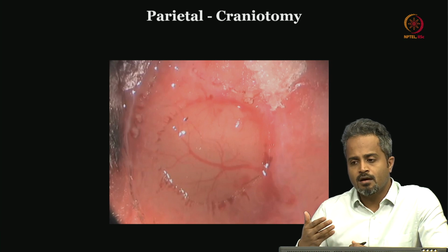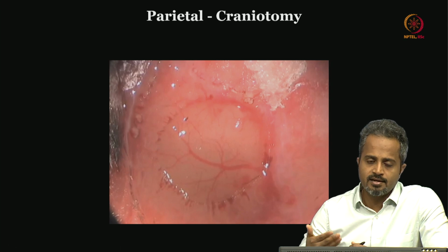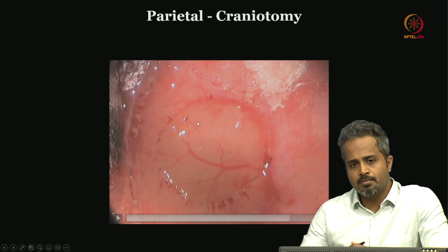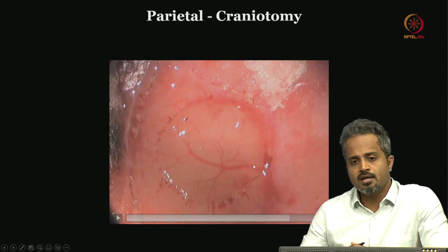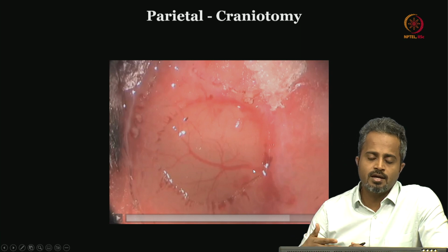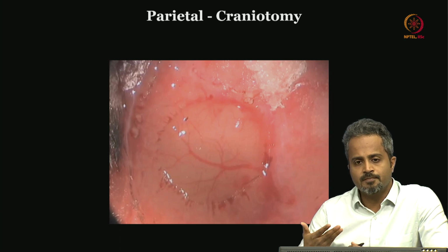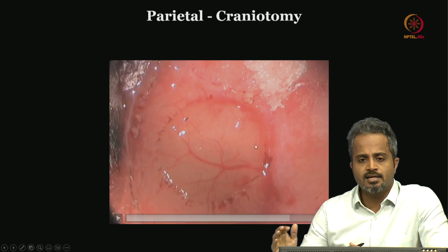All right, there are many instruments. A flat dissector usually is used to keep the dura intact before you lift up the skull. If the dura tears along with the skull, usually you can see here there is this vessel which can get injured, and if it starts bleeding, that part of the area which you actually wanted to study will get destroyed. It's called an ischemic infarct or stroke. That can happen because of iatrogenic injury. That is something introduced by the physician, or for that matter a person who is conducting the experiment. So that would affect the entire experiment and the outcome.